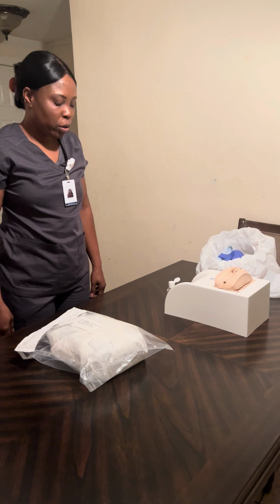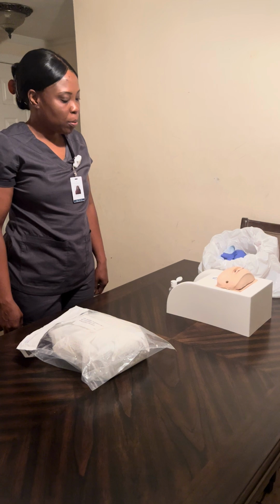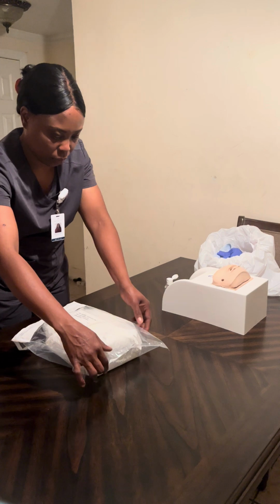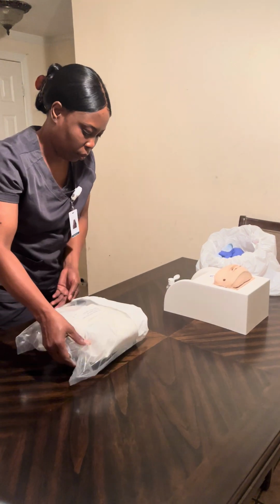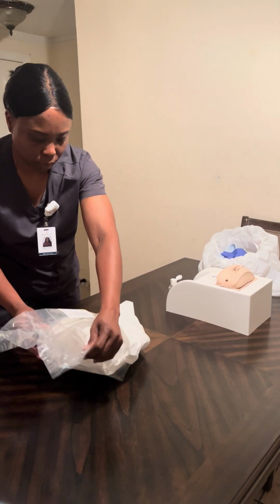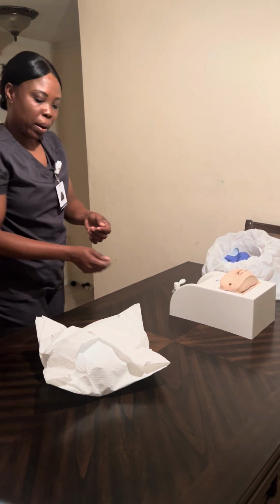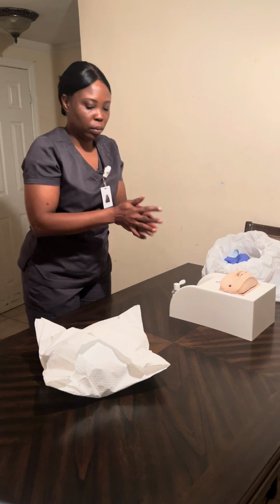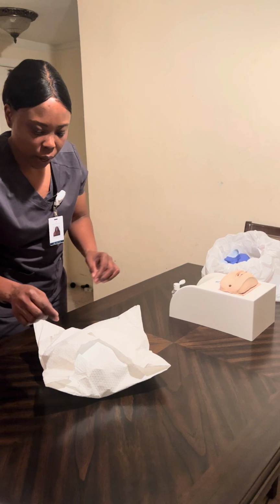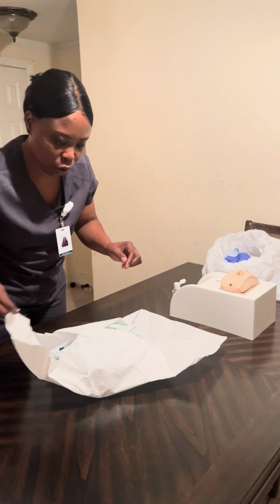Now, Mrs. Smith, I'm going to the sterility part. I'm going to insert the catheter for you. Is that okay with you? Okay, Mrs. Smith. Now I'm going to open my sterile kit. I'm gonna sanitize my hand again. I'm gonna open it from 1 inch margin. I'm gonna make sure not to touch it inside.